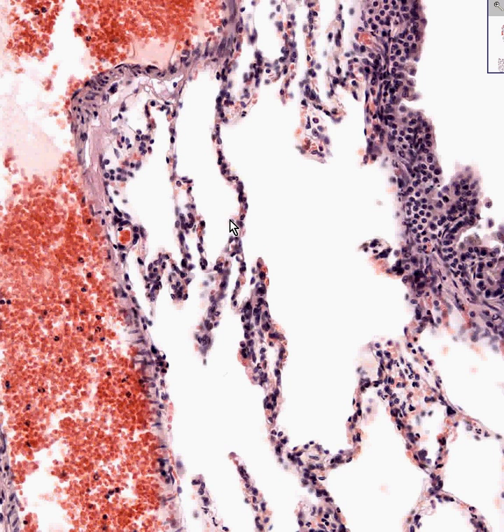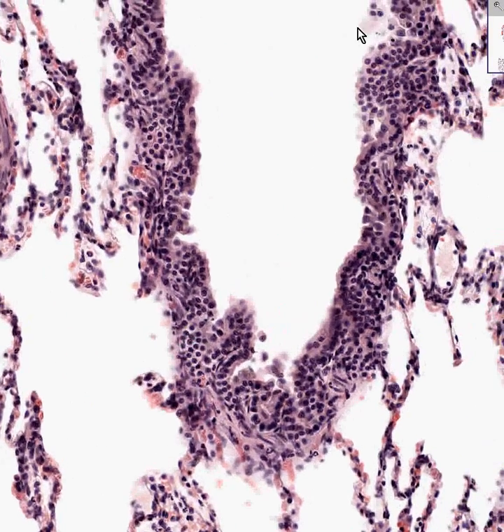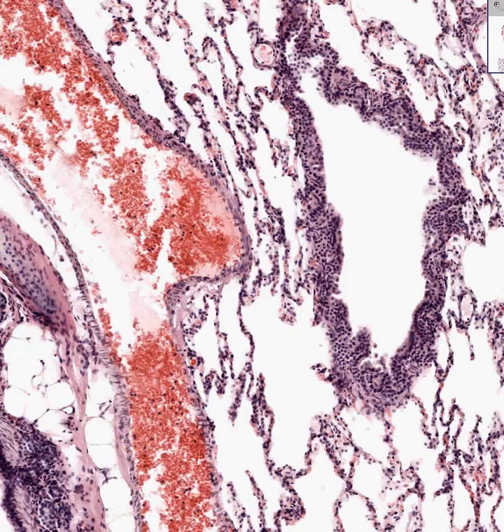If you see a pneumocyte that looks a little bit foamy, like perhaps here, almost looking like a mesothelial cell or a histiocyte, you call those type 2 because those are the ones that have surfactant. In addition, you can see cells like here, which are called Clara cells, which also have surfactant in the bronchioles as well. I really don't think there's anything here that we have ignored.